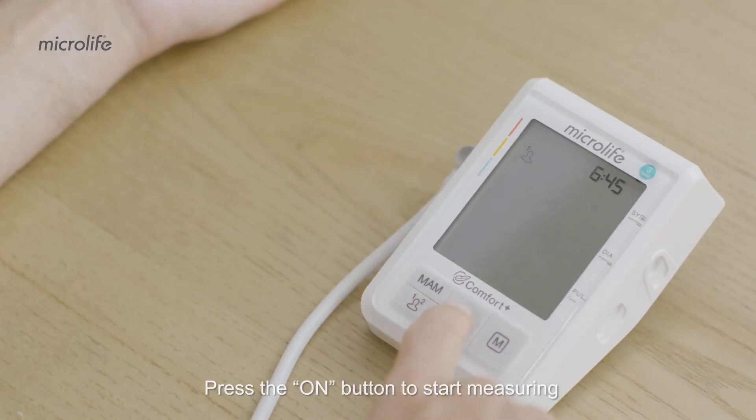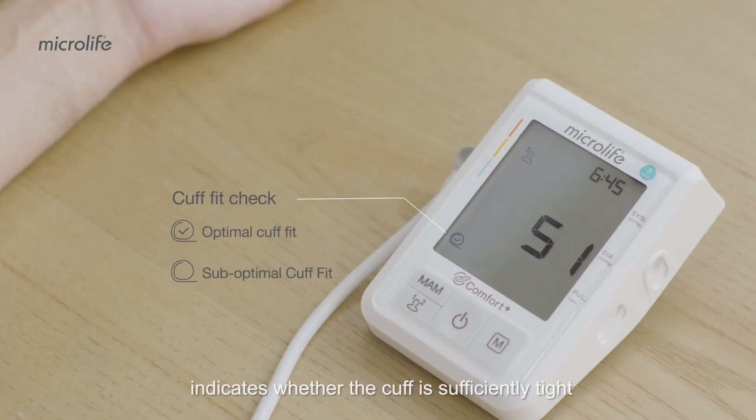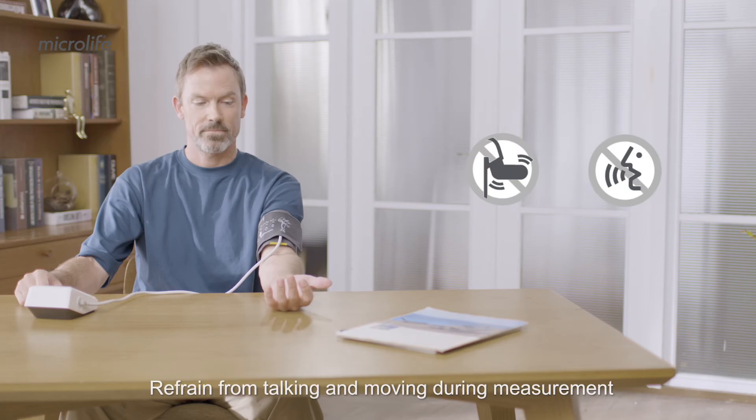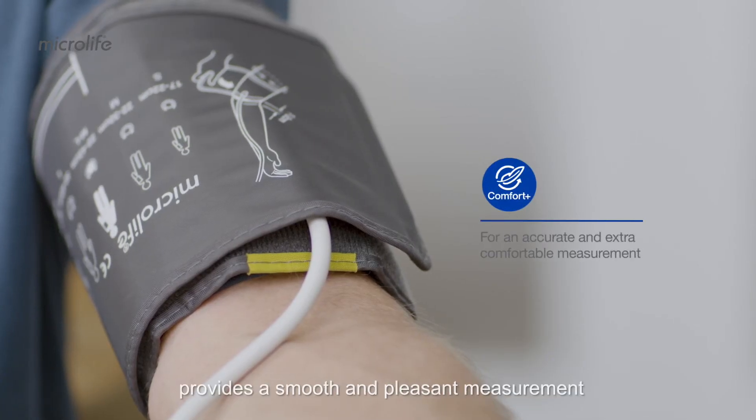Press the ON button to start measuring. During inflation, the Cuff Fit Check feature indicates whether the cuff is sufficiently tight to ensure measurement accuracy. Refrain from talking and moving during measurement, as the Comfort Plus technology provides a smooth and pleasant measurement.